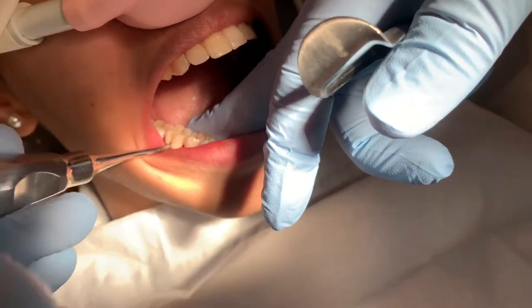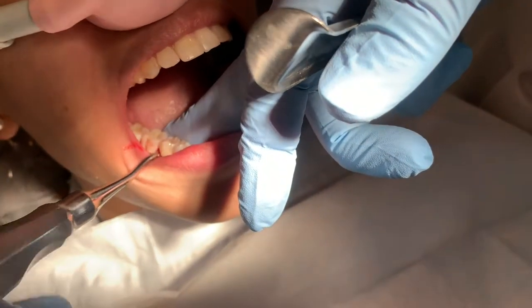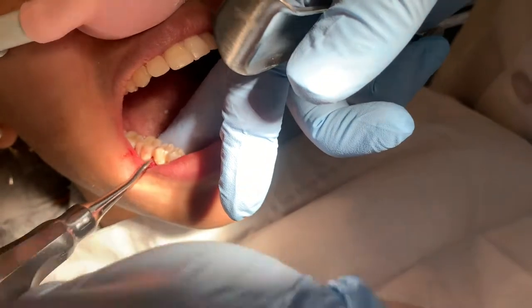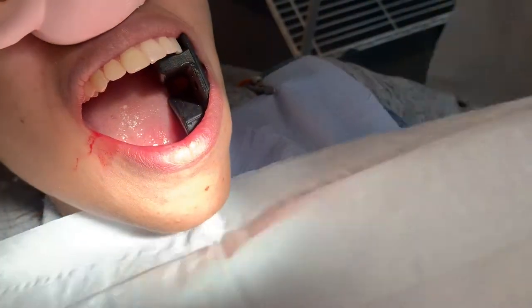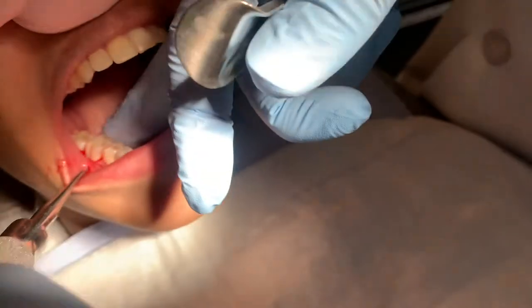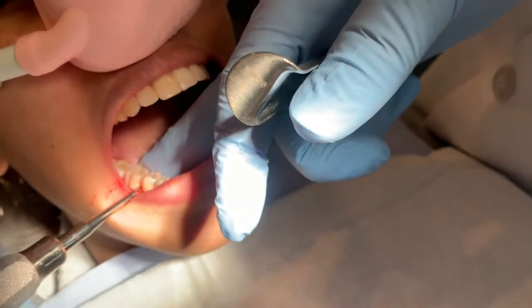Does that hurt at all? Mm-mm. You'll feel the pressure of me wiggling, right? But you don't feel any deep down pain. Okay. Does seem to be moving pretty well. You want to go slowly and steadily. Ease it out.